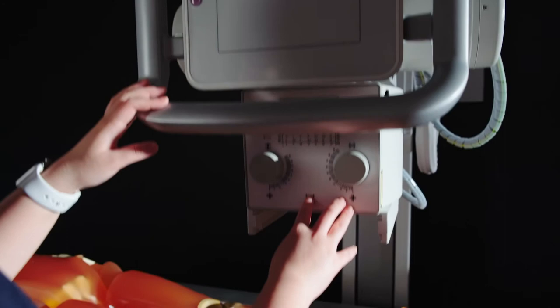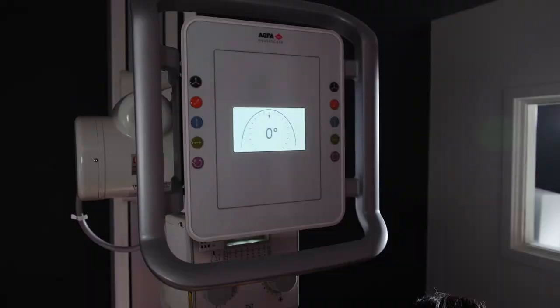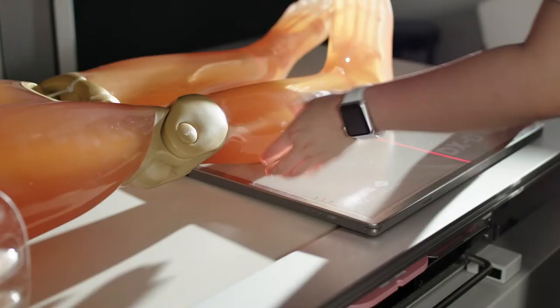Most people think that x-rays are just for bones and seeing whether they're broken or not, but that's a very, very basic part of what we do. Radiographers are also involved in cancer imaging. X-rays are also extremely useful if patients have any instrumentation post-operatively, lines, catheters, etc. in position. So it's also really useful for that as well.